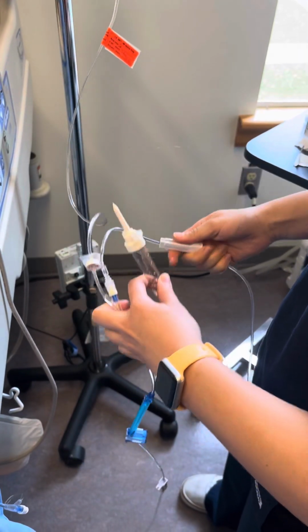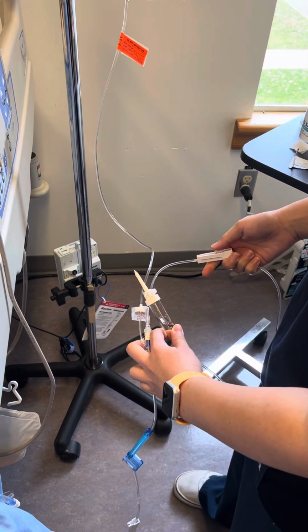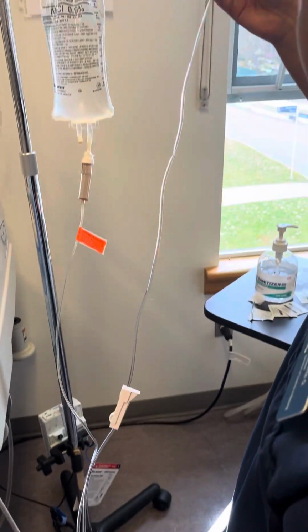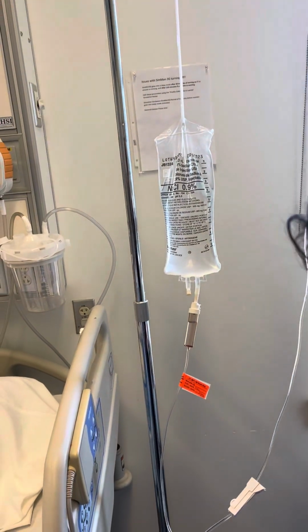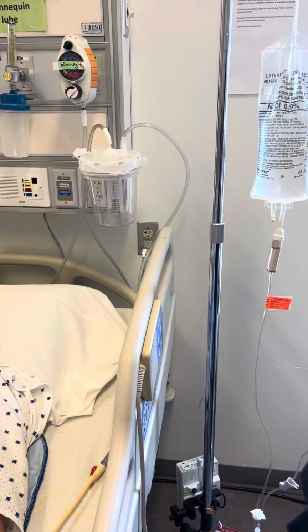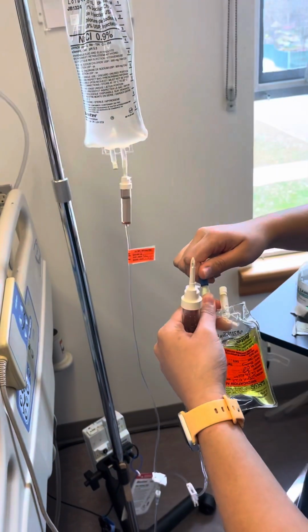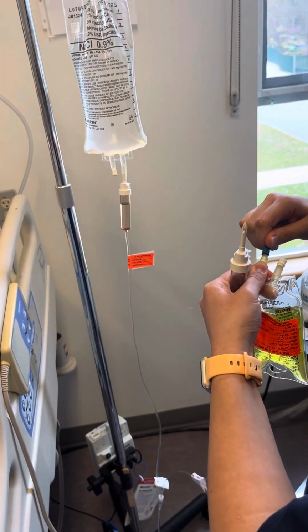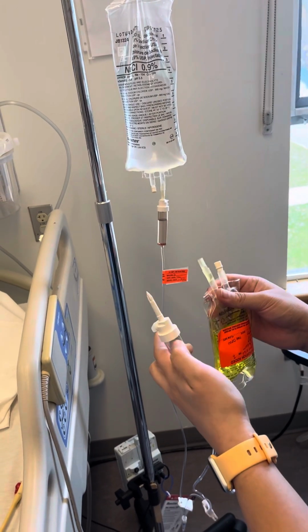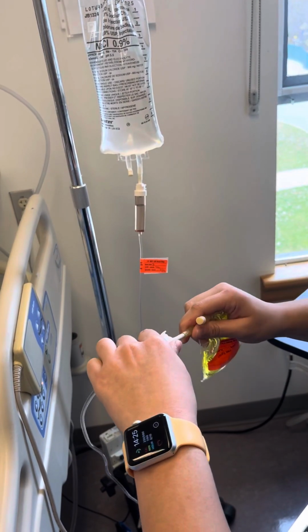And then I'm gonna open my line here. It's filling up, that's good. Close that, check for bubbles, no bubbles. Line looks good, okay. And then I'm gonna pop this off. And then keep in mind, this is sterile and that's sterile. There would be a cap on it, like I said. Pop that in there.